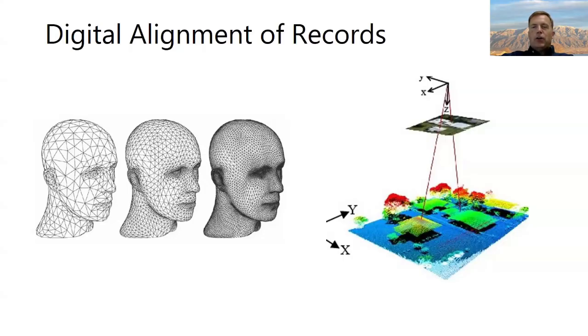So let's talk about the nature of a digital file that we use in dentistry. Every digital dental file, whether we create it with an IOS in the mouth or a lab scanner, is a point cloud. In the STL files that are most common, and I guess you'd say the generic format for dentistry, those points are grouped into triangles. And each of the points of the triangle is defined by its XYZ distance from a given point in space. This often invisible point is called the origin point of the file. Even though you can't see it, it's very important.